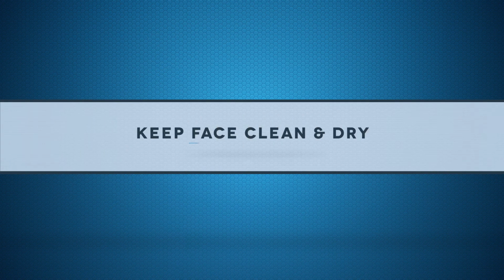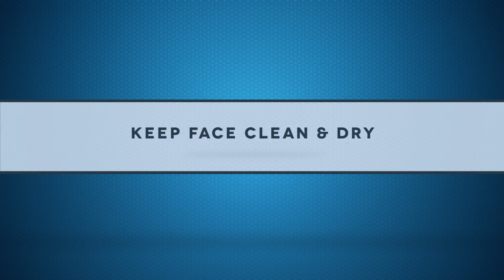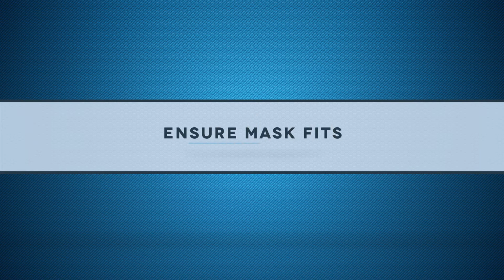While a mask is in use, make sure to keep the patient's face clean and dry. Moisture can build up under the mask and can cause irritation. Also make sure the mask fits, but is not irritating the patient's face. Adjust the mask from time to time to lessen the risk of irritation, and remove the mask for eating.